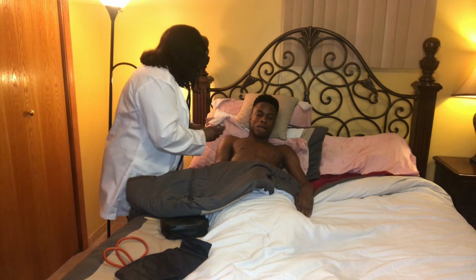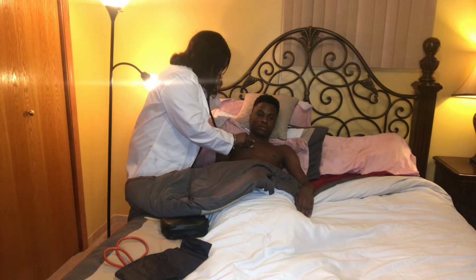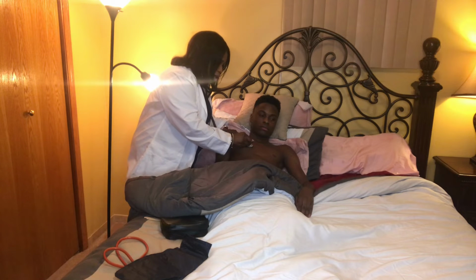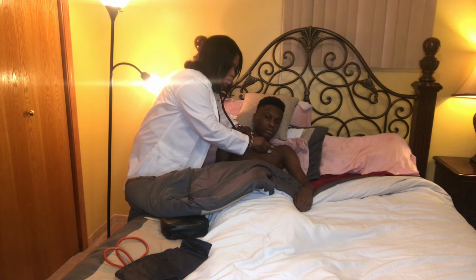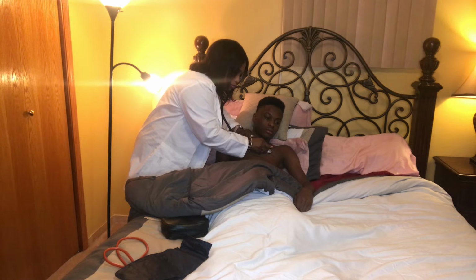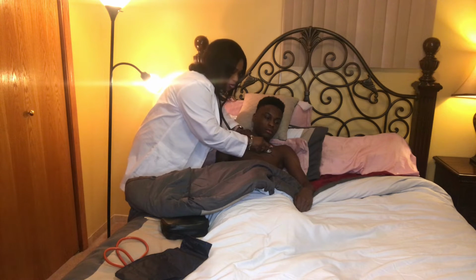Okay, so on your right second intercostal space, I'm listening to your aorta, which I'm able to hear the S2 sound right there. And also when I move to the left second intercostal space, I'm listening to the pulmonic, which also I can hear the S2 sound right there.